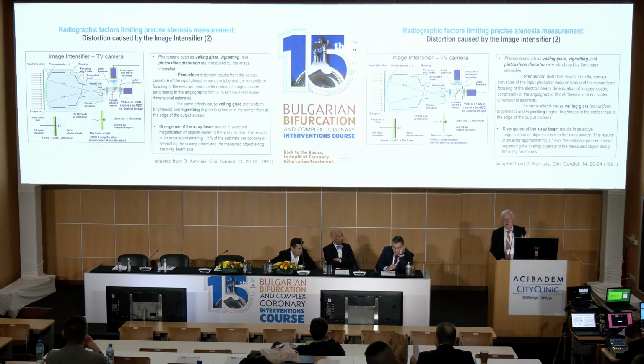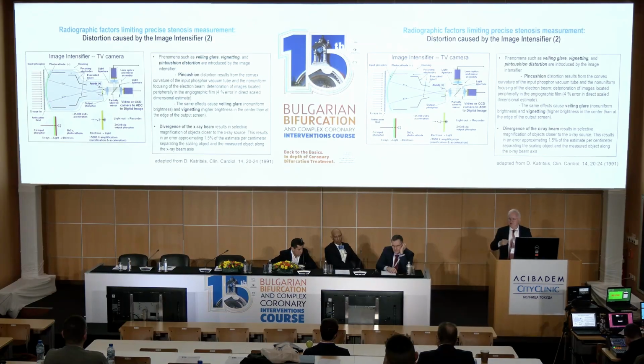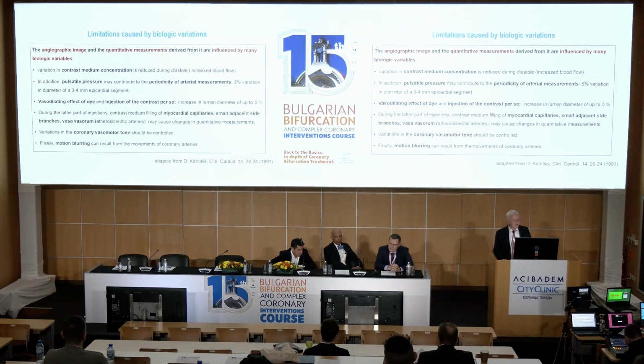So I want to explain a lot of this. You have many other factors that change the vision of the angio. A lot of distortion because the X-rays are dispersed, and for example, you have also a photon percuting an electron, creating in two directions one electron and one photon. This is well known. This is complex and probably not interesting for us.